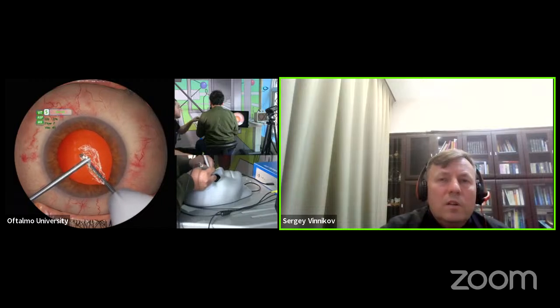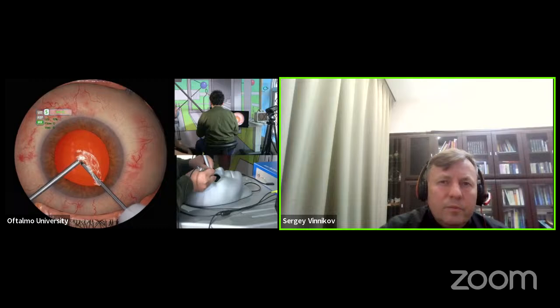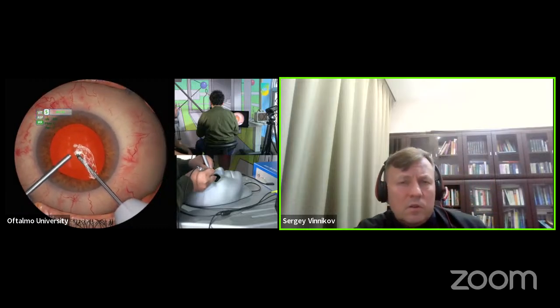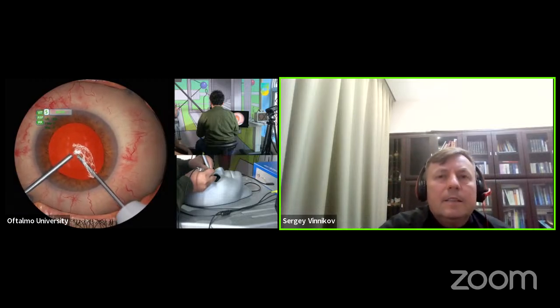Вот. И еще один момент, на который обратил внимание Эндрю: когда мы убираем витреотом, сразу нельзя убирать ирригационную канюлю, потому что сразу давление упадет в глазу. То есть перед выводом ирригационной канюли необходимо ввести вискоэластик для стабилизации.